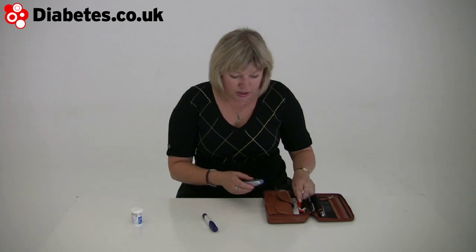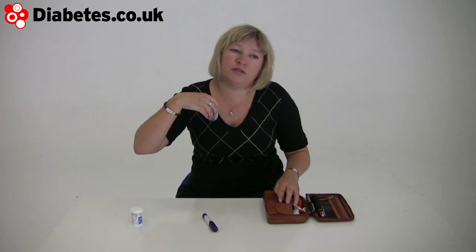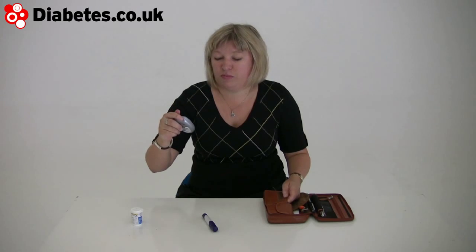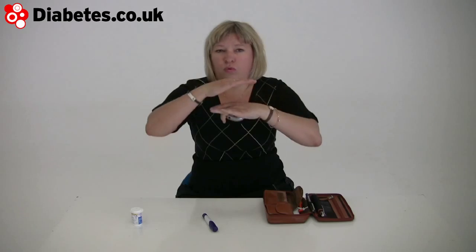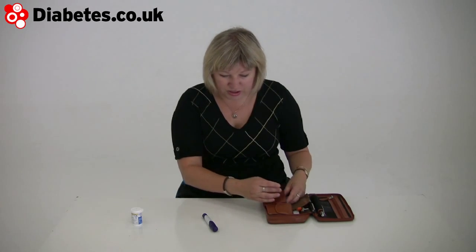The other benefit of this setup — not everyone is on a pump and not everyone currently has access to a pump. But should you go down the pump route, the Contour Link talks to the pump, and then you can download all the information from the pump through CareLink, which is part of the Medtronic setup. And that brings both your blood test readings and your insulin delivery onto the same graphs, which is really interesting.